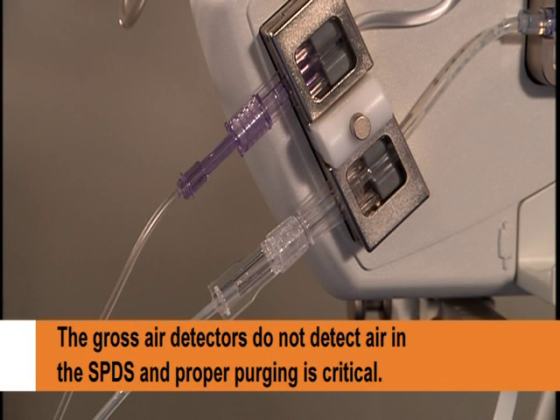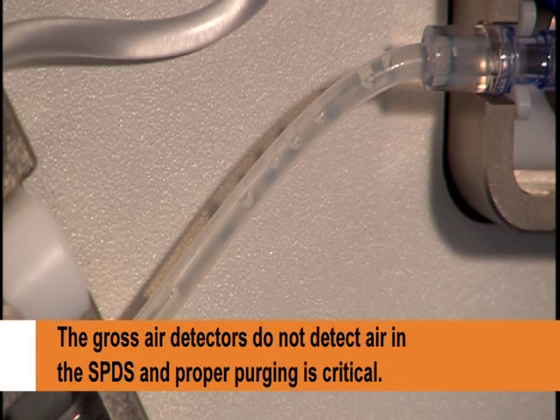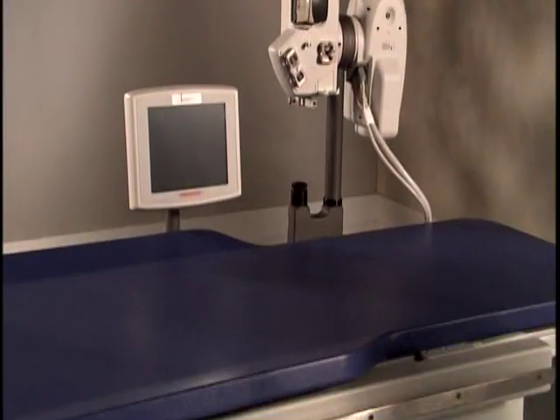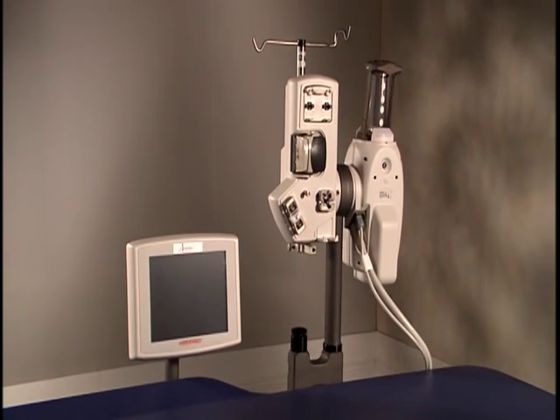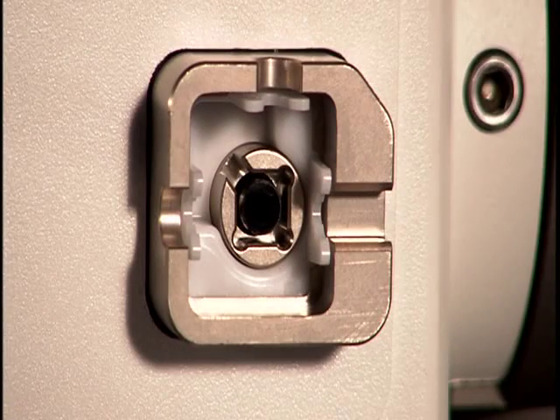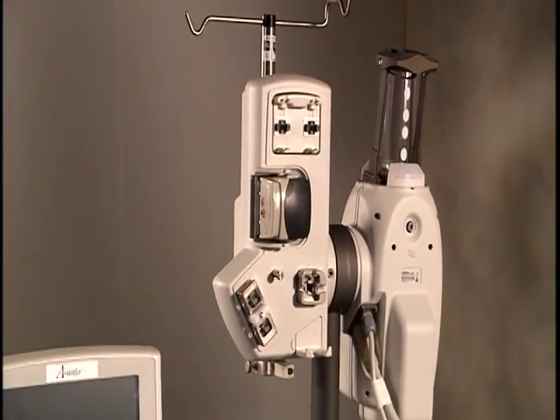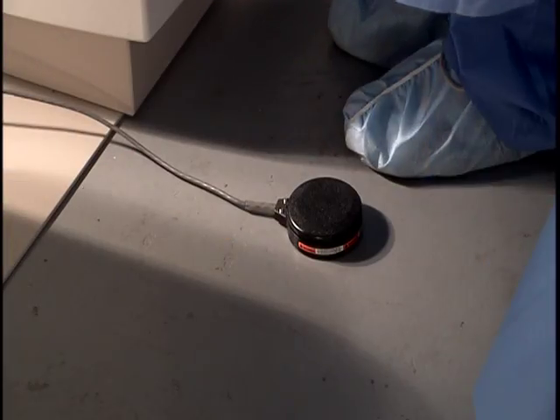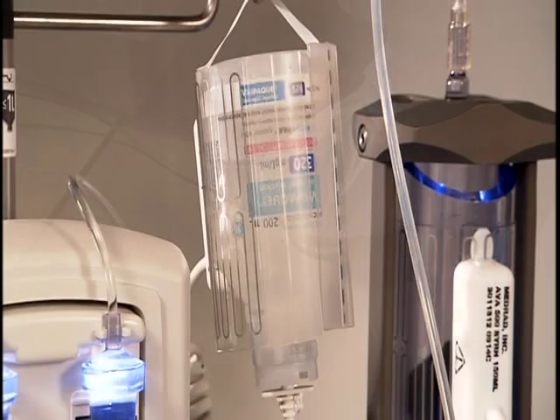Gross air detection is an important safety feature that senses the presence of gross air in both the contrast and saline multi-patient disposables. The contrast flow control valve, or CFCV, automates filling the syringe, injecting contrast media, and closing the contrast fluid path. The fluid control module houses the connections for the hand controller and optional accessories, such as the foot switch, bottle and syringe heat maintainer.